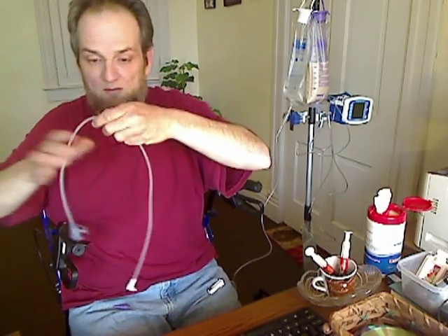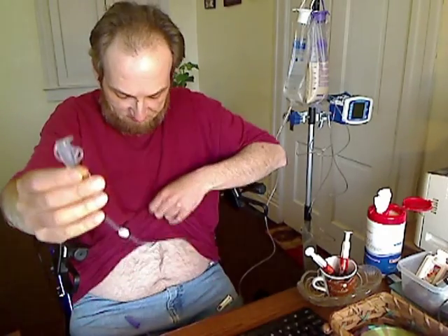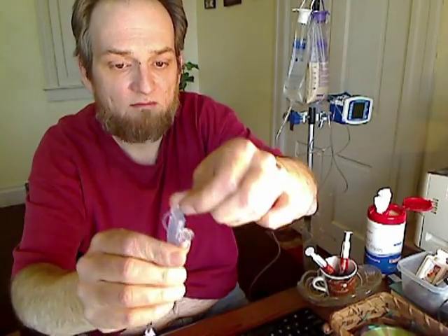And because I have the Mickey button, I have to connect my Mickey extension to my feeding tube. So what I'm going to do is I'm just going to go ahead and connect it. Put it in there, give it a turn. And if you see now, I have my two ports. I have my regular medicine port here on the side, and I have the regular bolus tip. Doesn't matter if you use the single or the double hose, this will work for you.